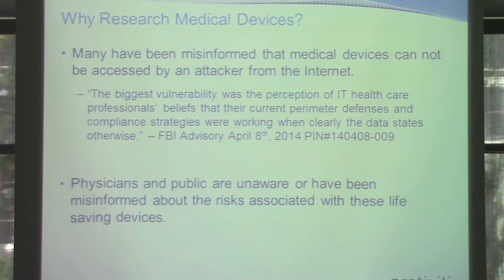This was an FBI PIN. It came out in April, with 2 in April. The FBI is kind of new to the game; the first releases started coming out on medical devices. Anyone know Billy Rios? Familiar with that name? Okay. He's another researcher that has spent a lot of time and reported 300 hard-coded credentials in medical devices to DHS and the FDA, just about a year and a half ago, June 2013. And so the FBI got involved, and they're really looking at it now. They have an interest in it. They're also looking at it from the financial crime side, so not just a patient safety issue, but also from a patient privacy and medical records angle, like what happened with CHS.